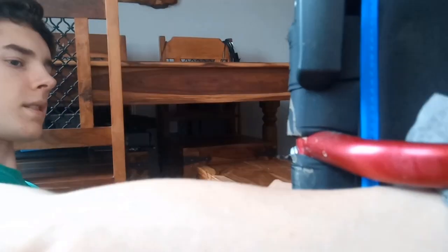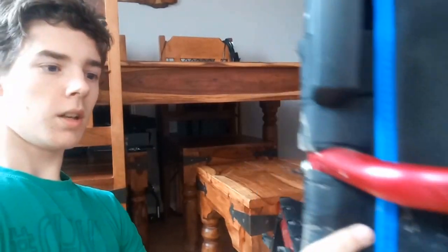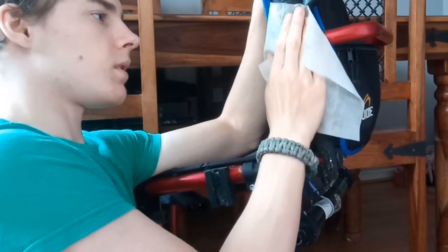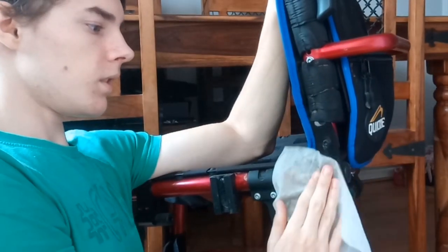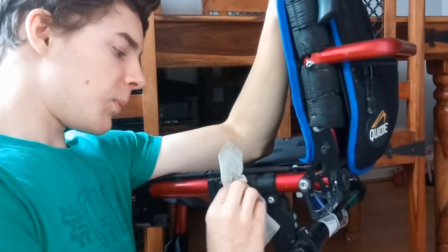Now this side is a little bit worse for a couple of reasons, because now I need to hold it up, but also it's got a lot more mud. I don't know if you can see that, but I think this is probably going to be the best position. And obviously the wheels would stop me from doing this normally. So just gotta clean it.